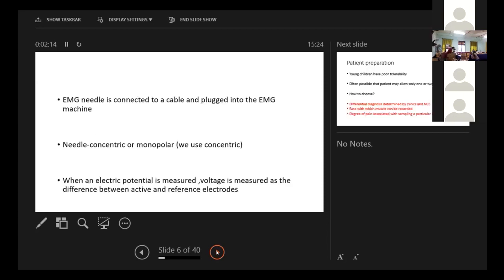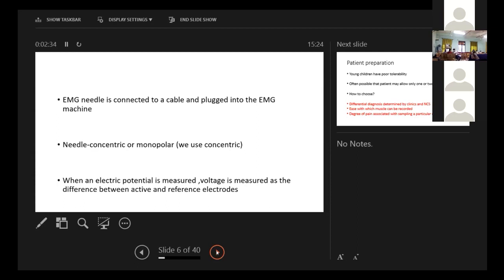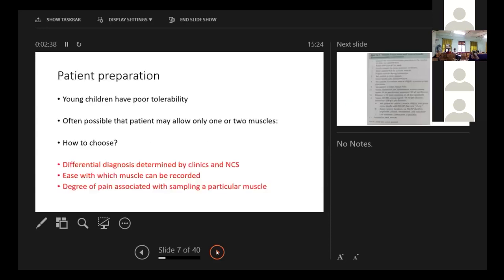We will see in the video, the EMG needle is connected to a cable and plugged into the EMG machine. The needle may be of two types, concentric or monopolar. We use concentric that has got the active and reference electrodes in the same side and actually what is recorded is electric potential, which is a difference between the active and reference electrodes.